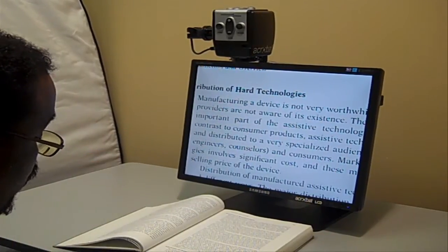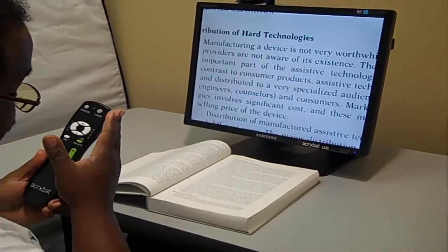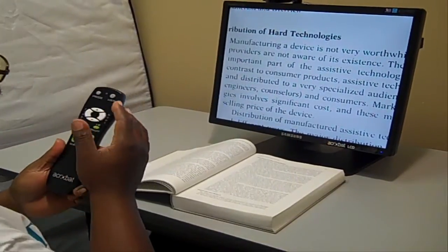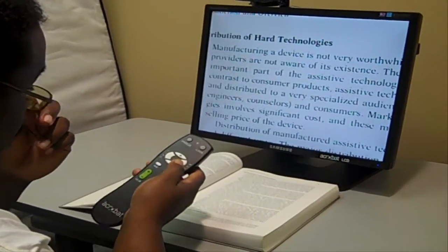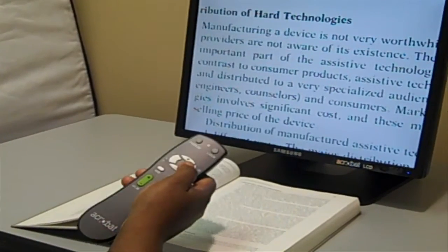I'm going to show you how this CCTV works. First of all, we're going to start with the different modes. It has two different types of controls to change the settings. You have a remote — it has the mode button on it — and it also has another mode button on top of the lens at the very top. I'm going to work with the remote first. The mode button changes the different types of colors depending on your vision and what makes you see better.